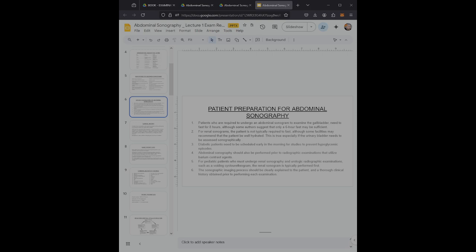When we're describing pathology, we describe it sonographically with relation to the surrounding or adjacent tissue. For example, a hepatic mass may be described as hyperechoic compared to its surrounding echotexture. A renal mass may be described as hypoechoic with a central area of increased echogenicity. And then a cyst might fit certain criteria. We might call it simple, we might call it complex.